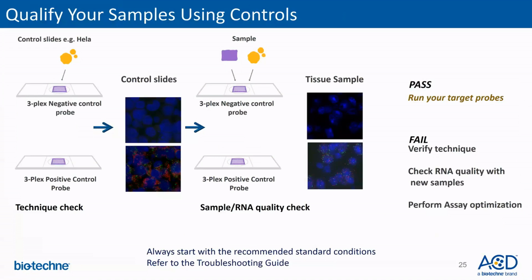On the top is shown a picture for the negative control, where it only shows the blue staining for the nucleus and no RNA staining or no punctate dots. And at the bottom, you see the multiplex positive control probe showing the RNA as punctate dots, green and red.